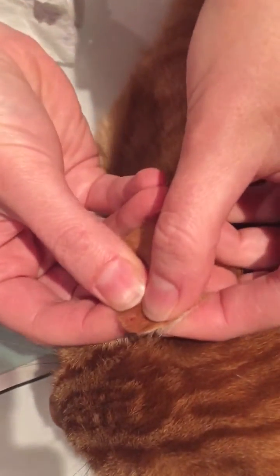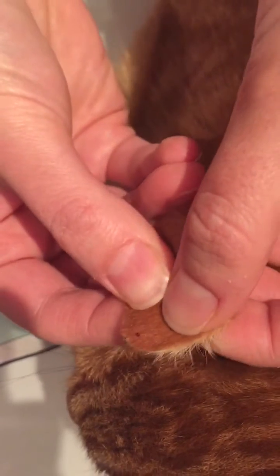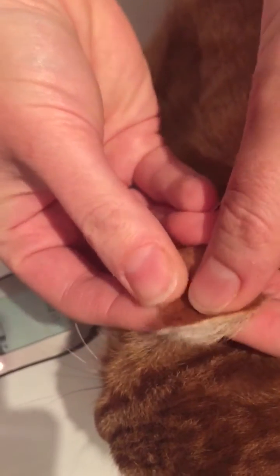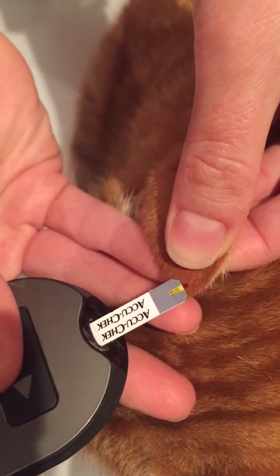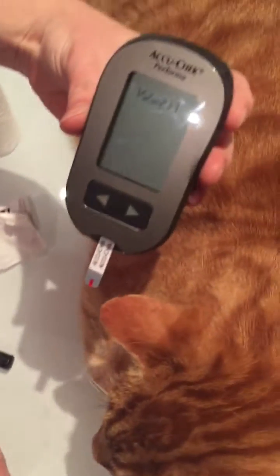I'm just going to gently massage that out. His ear is just a little bit cool from being outside. Now I have a droplet that I know is the right size — you'll get to know this. I'm just going to pop the meter on here and wait for the result.